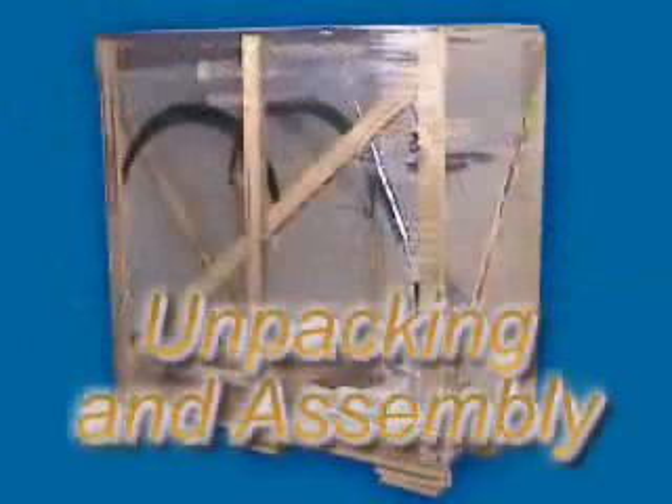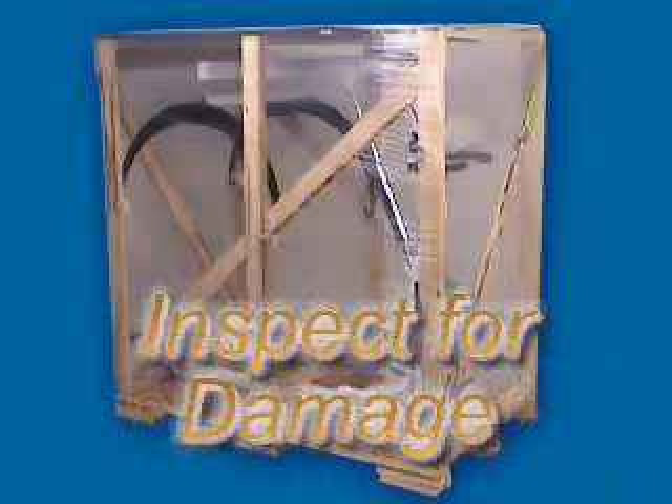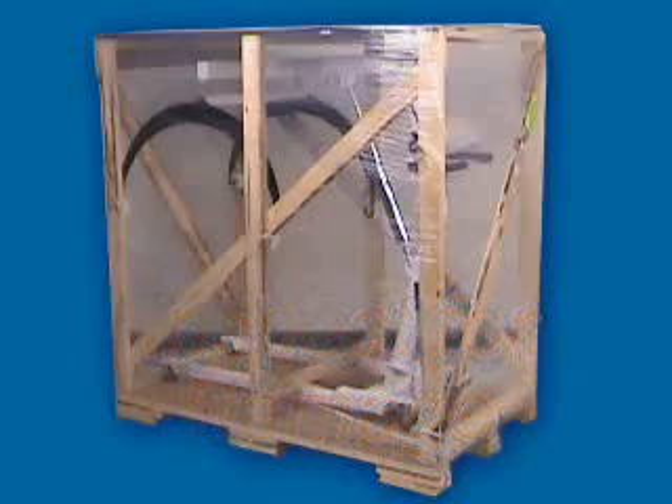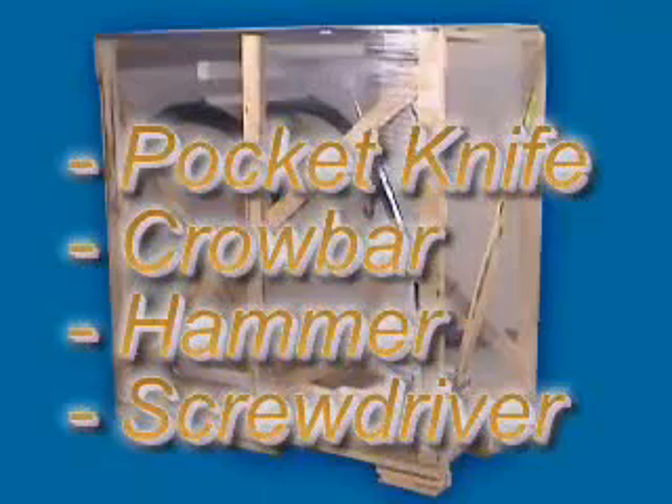After receiving and uncrating the IB600 from its outer container, you're ready to unpack the unit from its inner crate, assemble, and use it. Be sure to check for any parts that may have been damaged in shipping and report them to the carrier. Unpacking and setting up the IB600 is simple — it comes virtually assembled. All that you need for the task are a pocket knife, crowbar, hammer, and screwdriver.